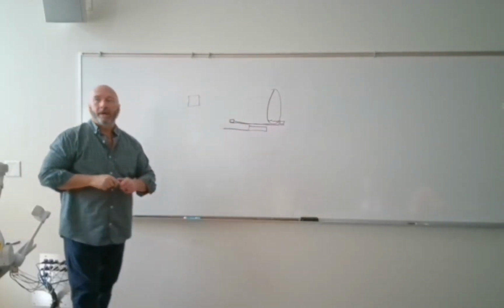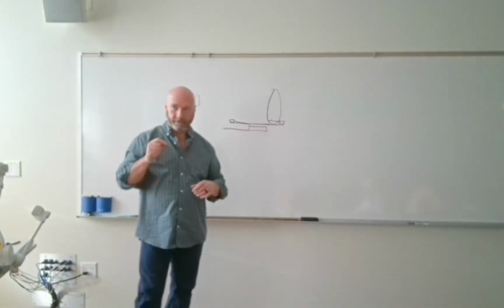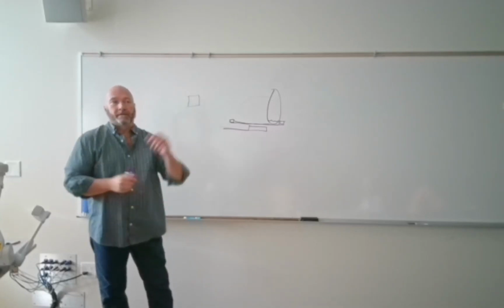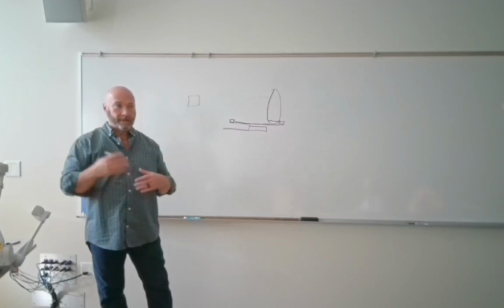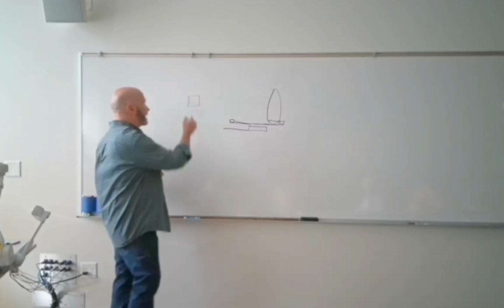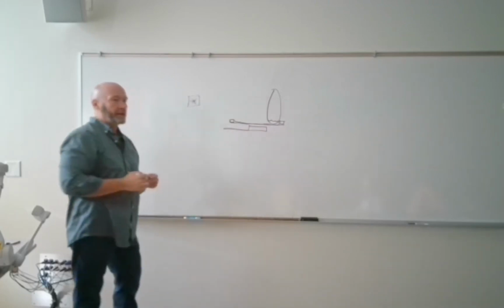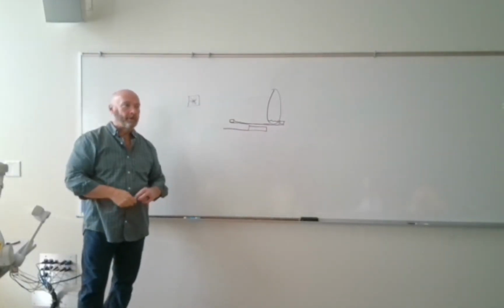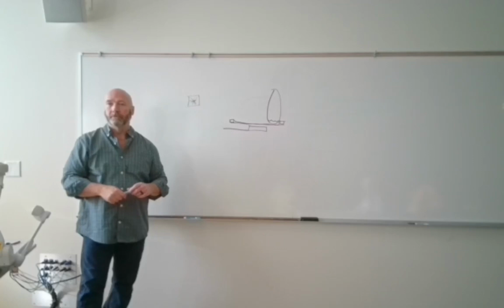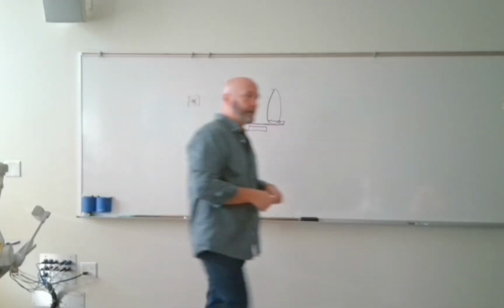Okay, so we have a word for how the x-ray beam comes off of the anode. And the meaning of the word is with equal intensity in all directions. All right, so the word is isotropic. It's isotropic emissions, comes off equal intensity in all different directions, which means that we create x-rays in here and they're going all over the place, right? I think I use the analogy, it's like dropping a bowling ball in a mud puddle. Where is the mud going to go? Everywhere. It's going to go everywhere, right? That's exactly what happens whenever we create x-rays.